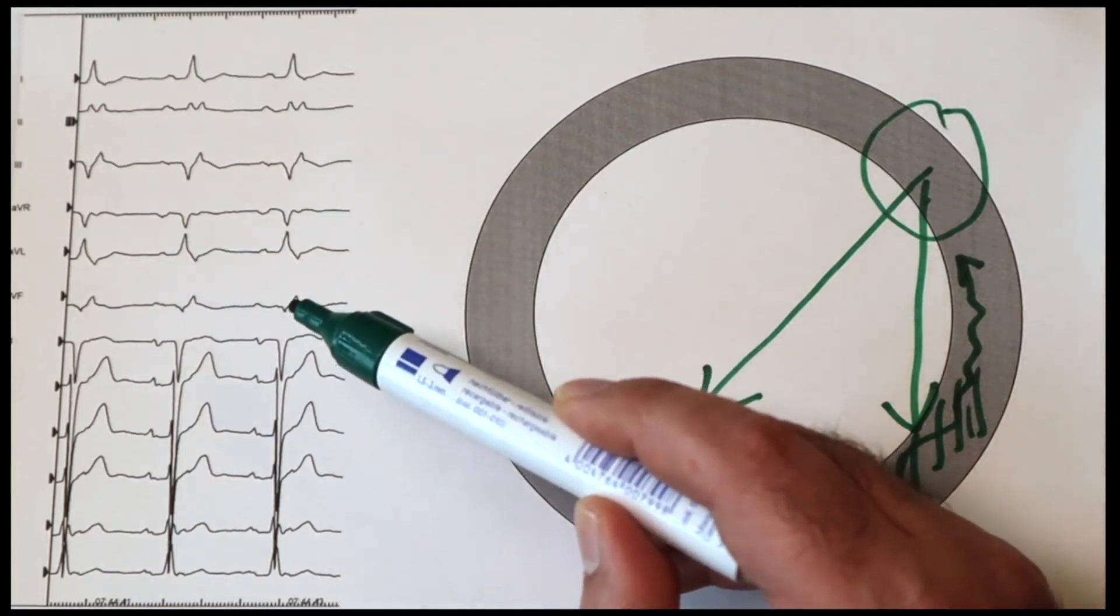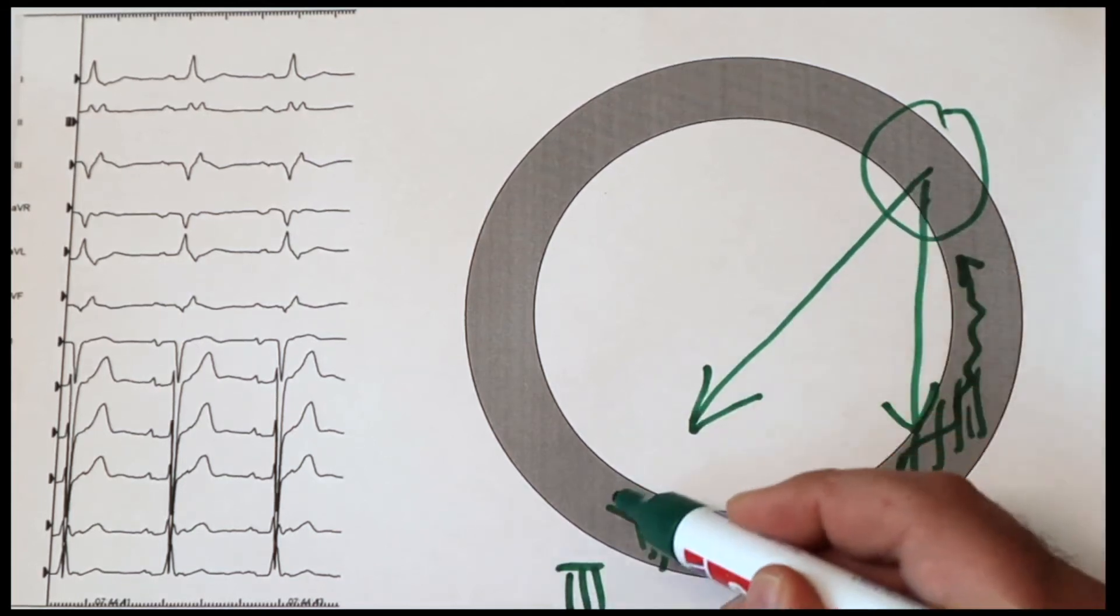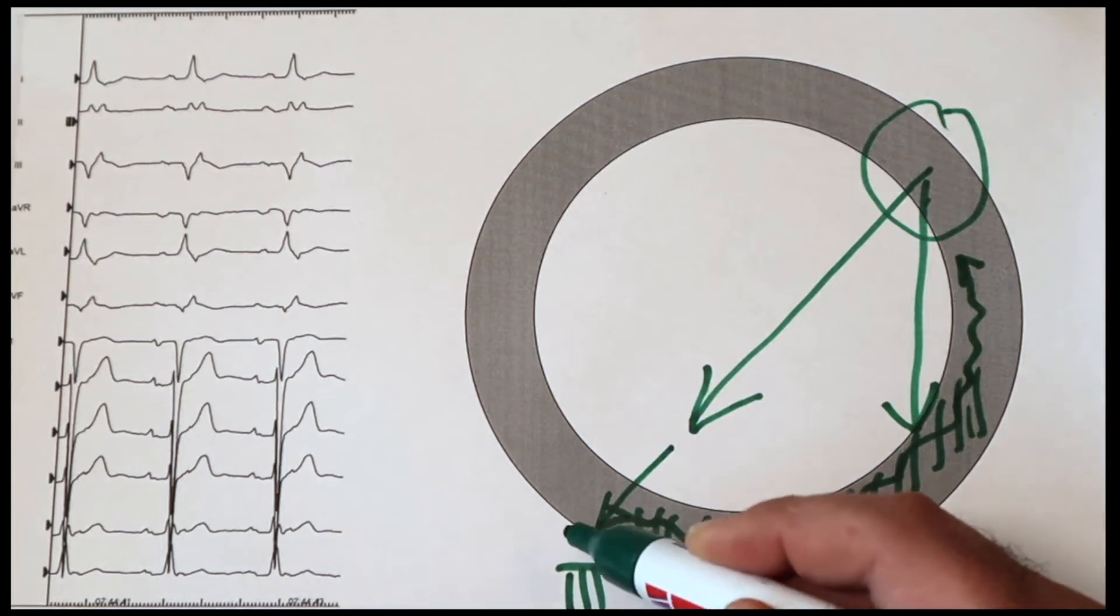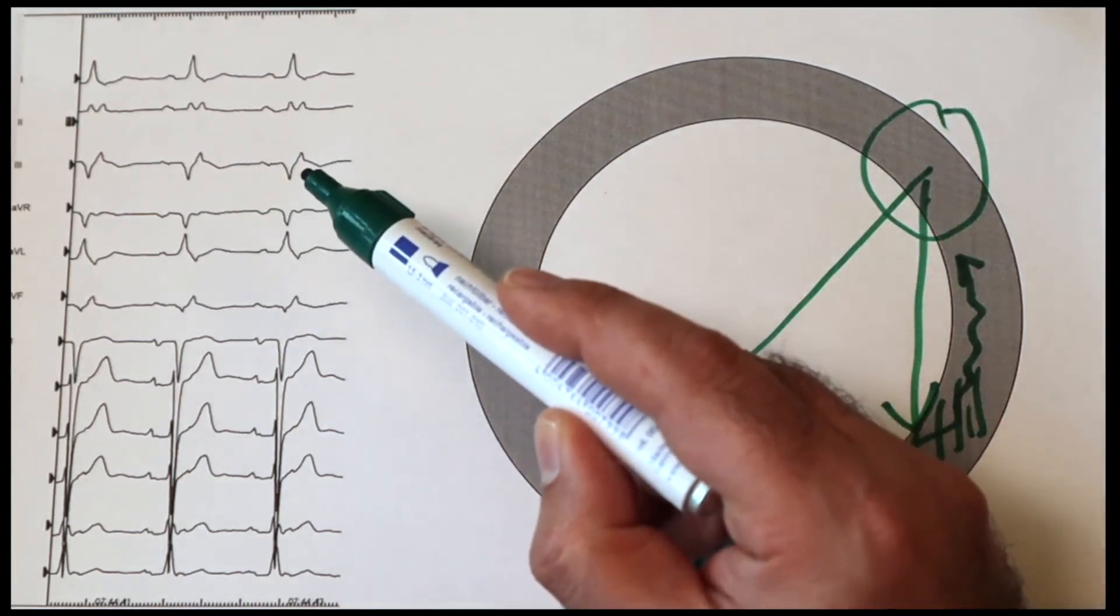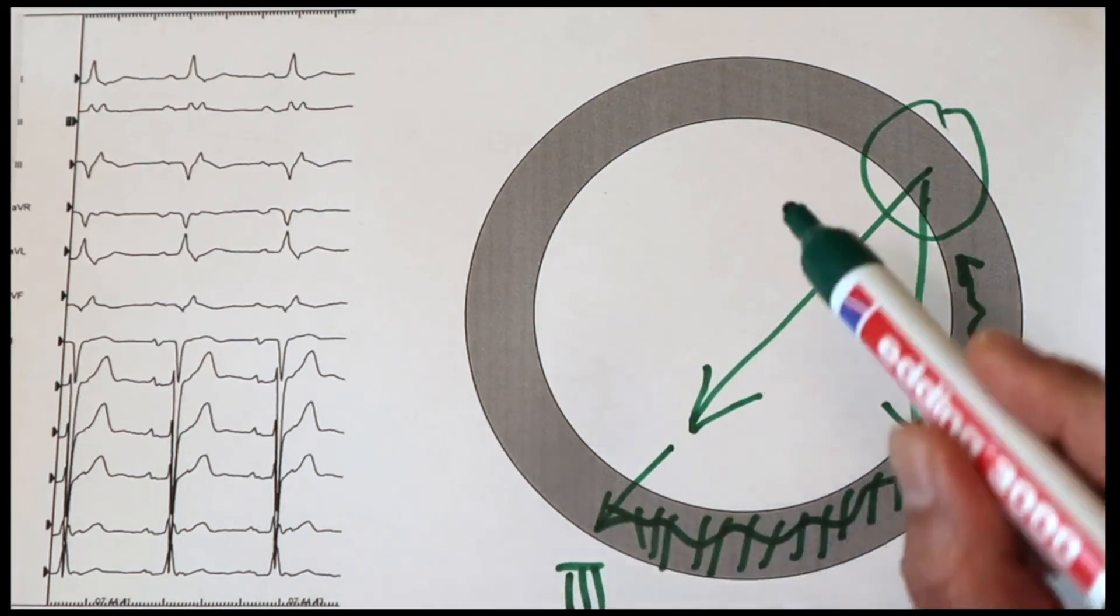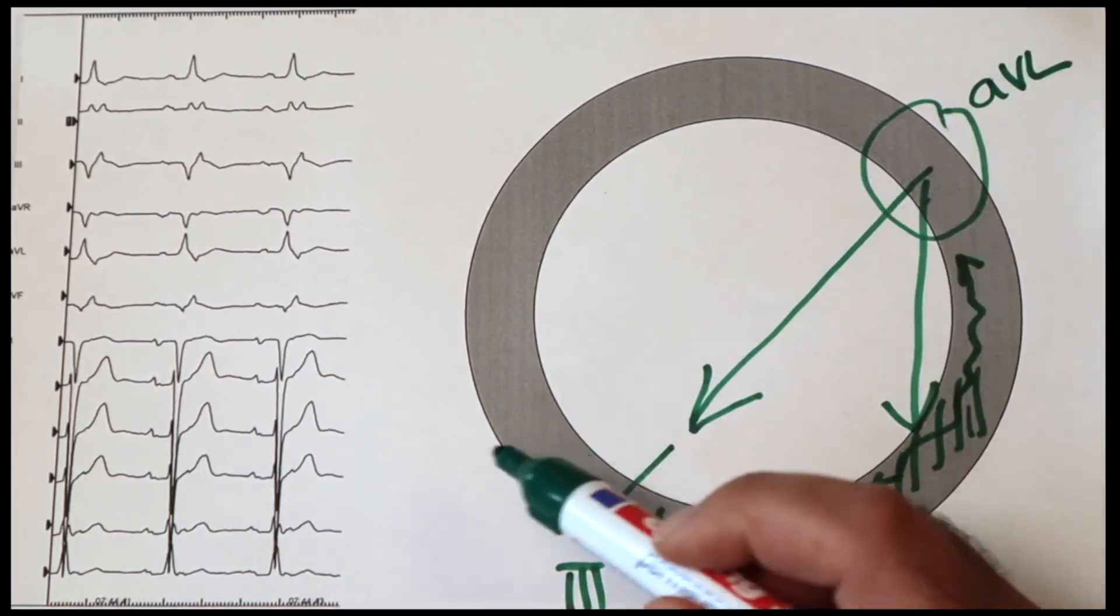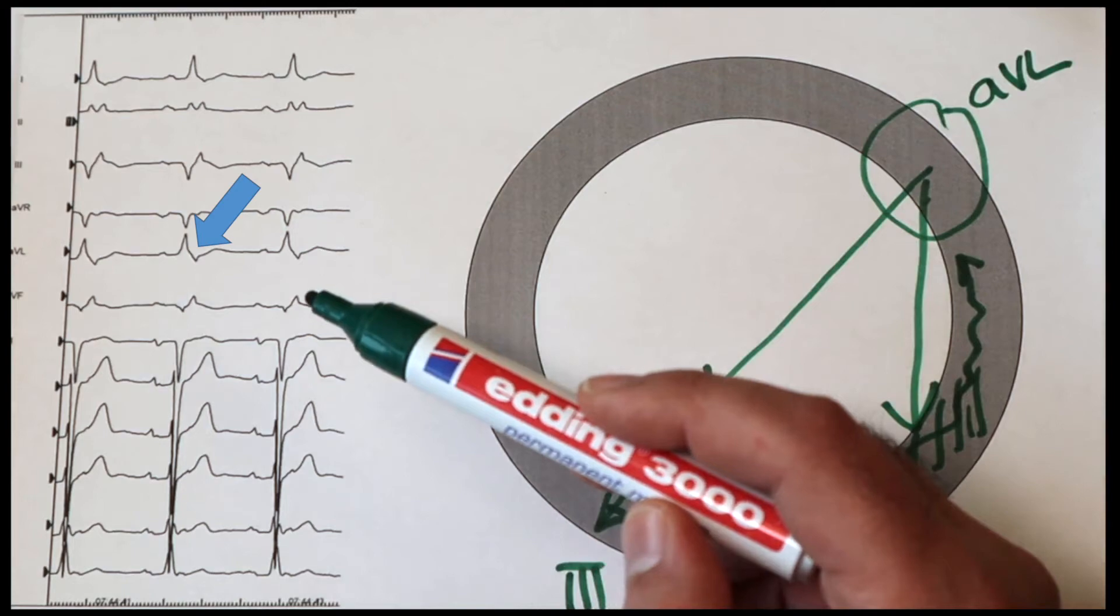And exactly that's the reason that we see these positive deflections in II, III, and also aVF. And because this deflection goes directly toward lead III, then the most positive deflection is in lead III compared to lead II and also aVF. And as you can see, if the most positive deflection is in lead III, then the most negative one should be in lead aVL, which we see clearly here in the ECG.